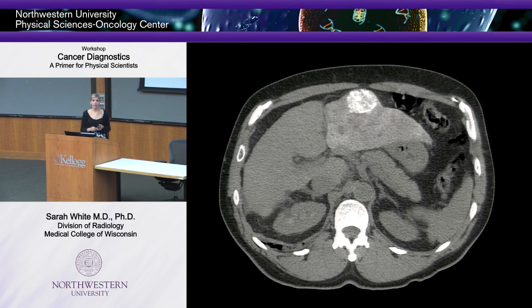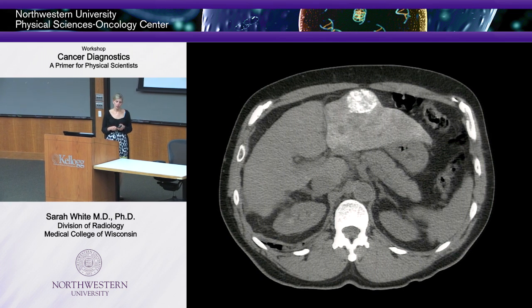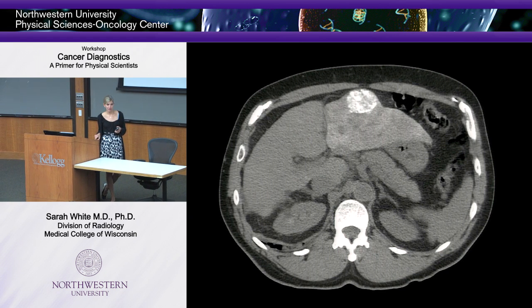So I could try that again. Just say, that didn't work, let me try again. I don't really like to do that. Try it and it doesn't work. So we decided, well, we could do something else maybe. So there's something called ablation. Okay, so you can do cryoablation, you can do microwave ablation, or you can do radiofrequency ablation.